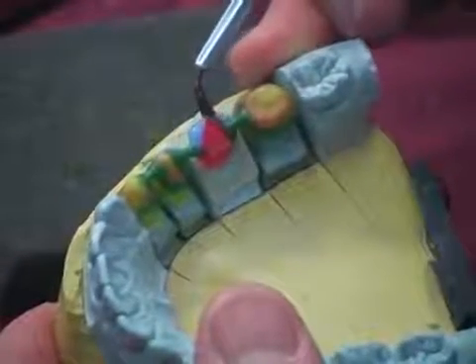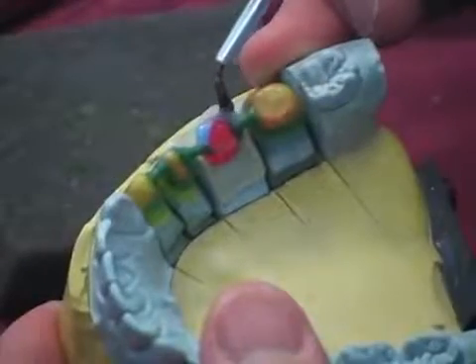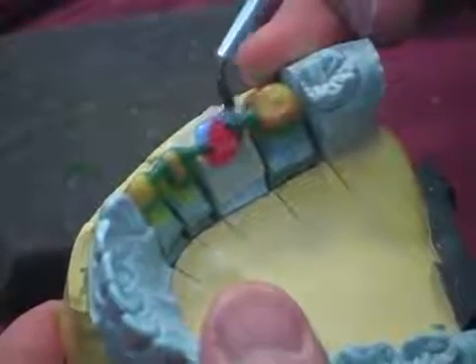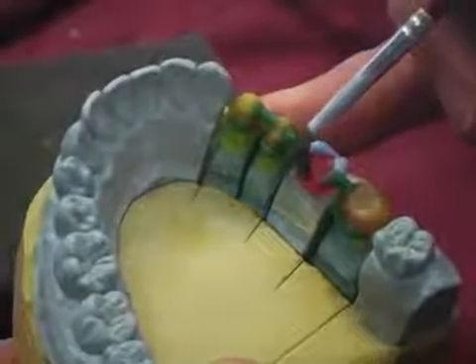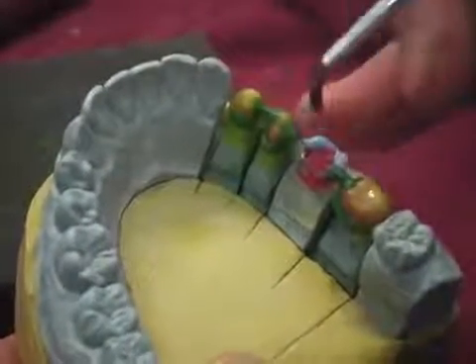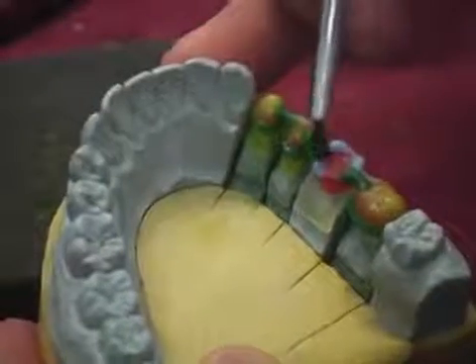We can easily use the brushing wax to build up pontics to the ideal contour without causing stress or strain on the parent Galileo wax. Once this technique is mastered, it is as easy as stacking porcelain.